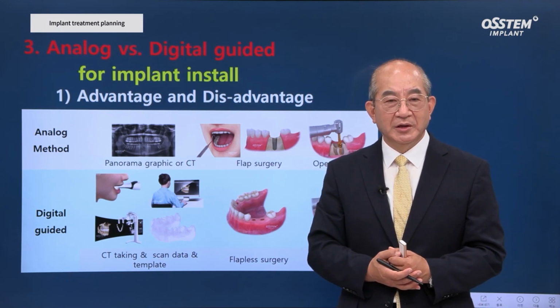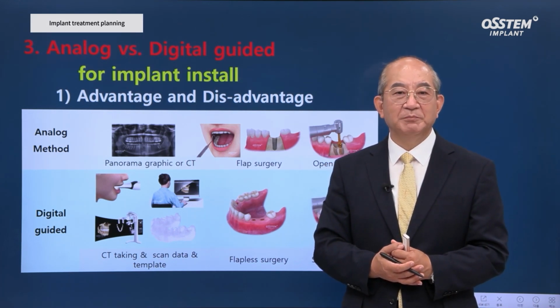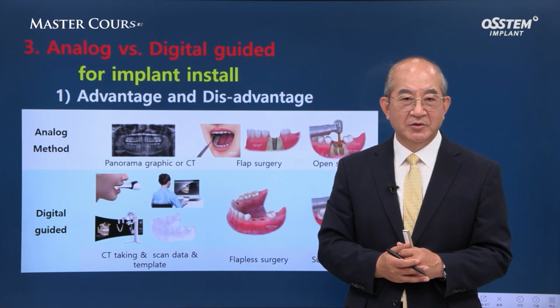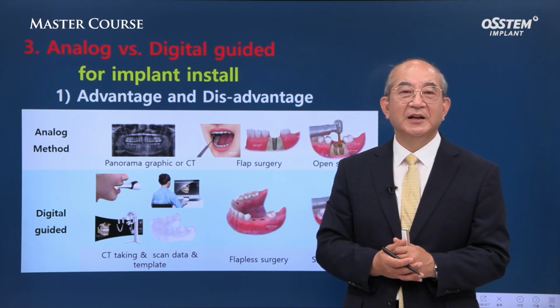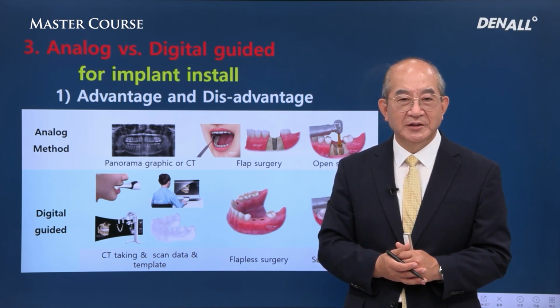Treatment planning is the topic I've talked about today. The basics is that we need to center our treatment plan on the top-down method. And I recommend digitally driven implant treatment planning.